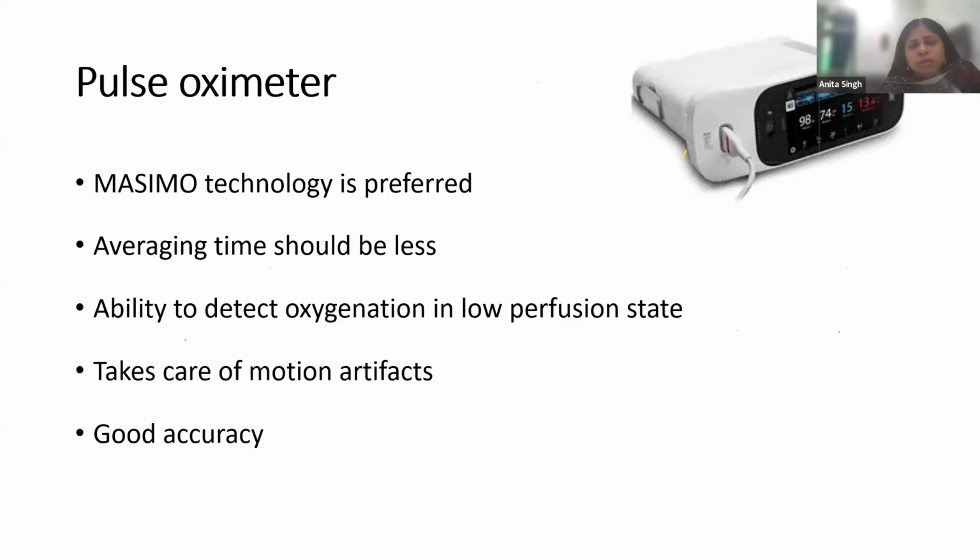So the brand should have a good signal extraction technology, which should be taken care of while deciding about a pulse oximeter.